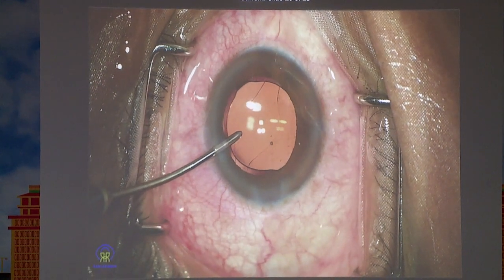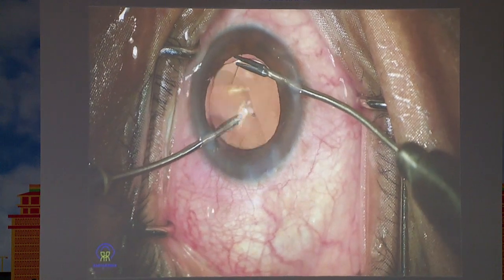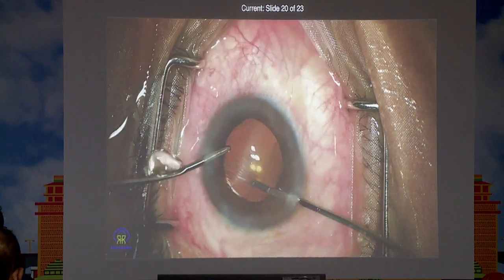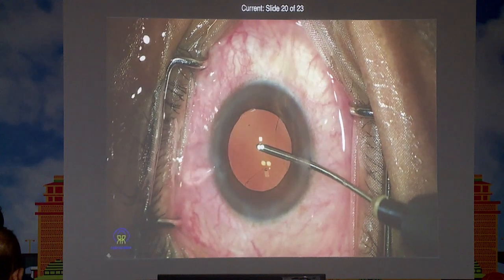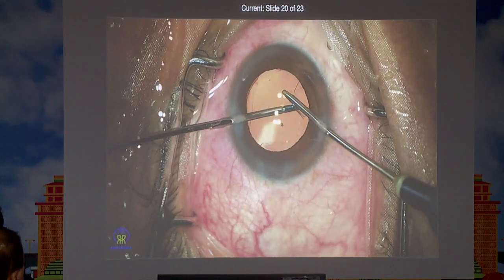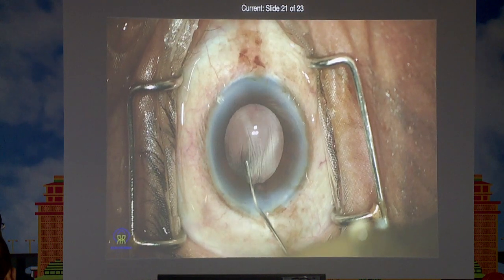And after the IOL has been placed, which is single piece, and the haptics have been aligned in the available portion of the capsule, then I decide to extend the rhexis margin to make it look more circular while the coverage is being adequate. So I do it under the cover of BSS. No viscoelastic needs to be used here. Just flaps on either side port, introduce the micro rhexis forceps and complete the flap just like that.